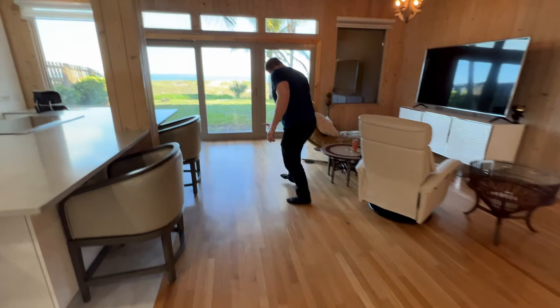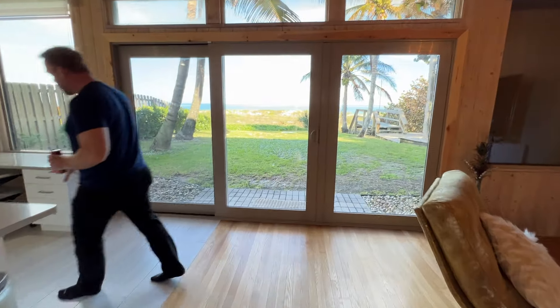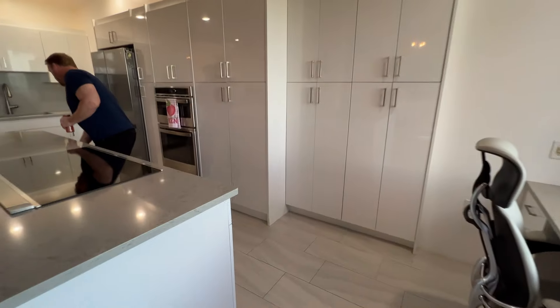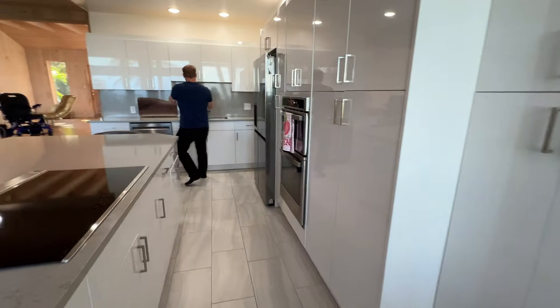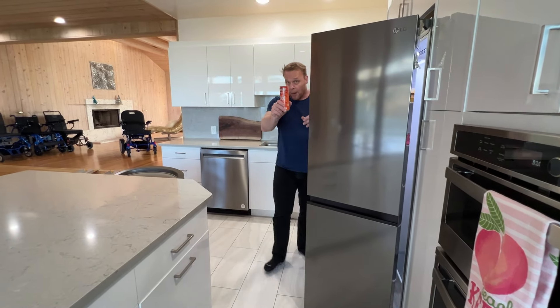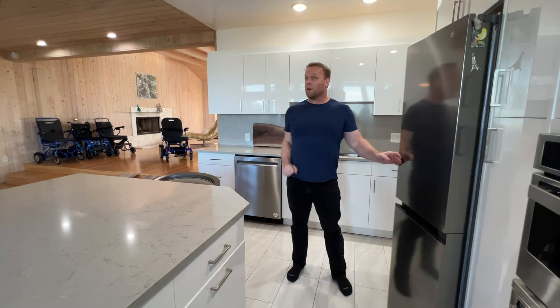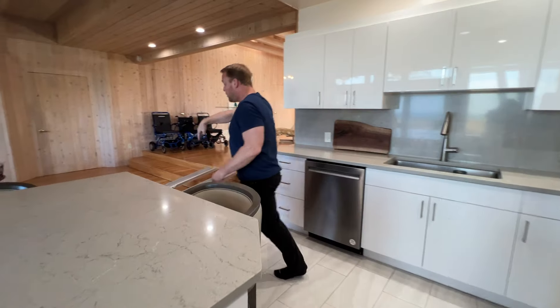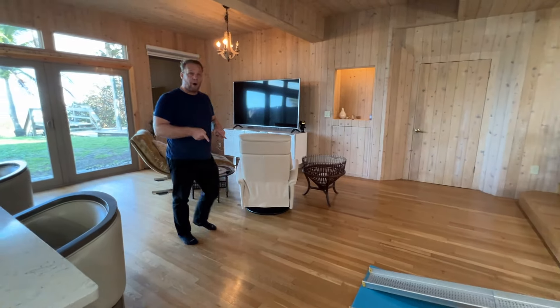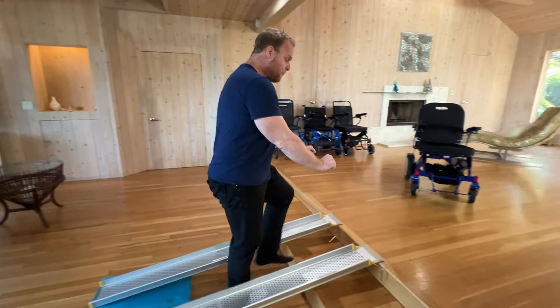Once we get downstairs, we are going to go into the kitchen and navigate in a tight area. I'm going to come all the way up to the sink, back the chair up, open the fridge, grab a drink from the fridge, and take the drink into the living room so I can put it on the table. Then I'm going to swing back around, put the chair in freewheel, turn the chair off, and see if I can push the chair up the ramp without any complications.